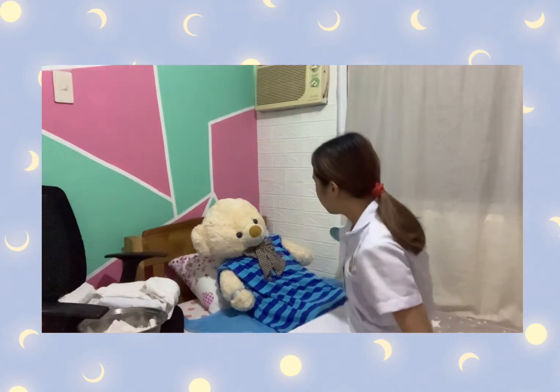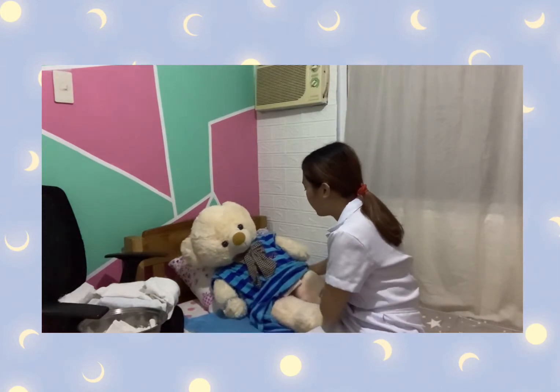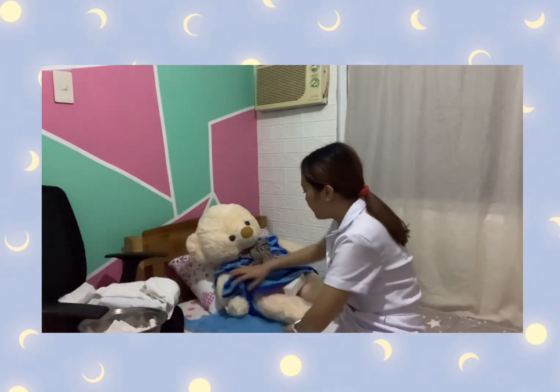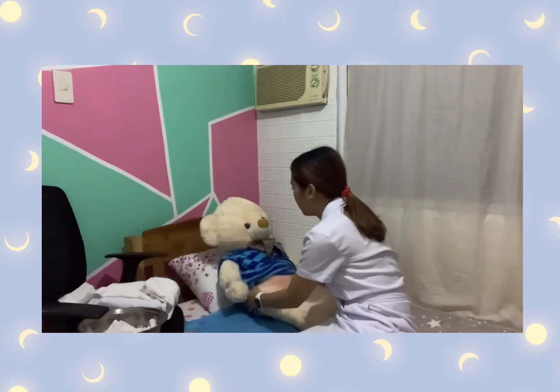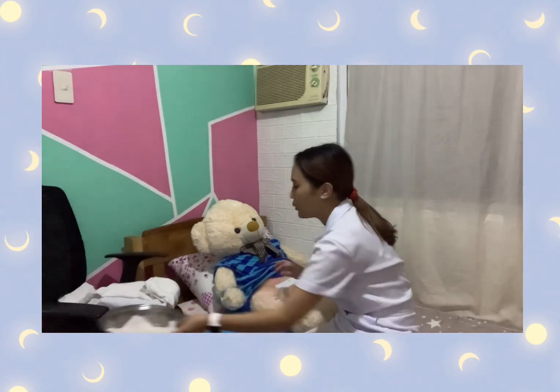And then, now is the time for us to prepare our patient. We will expose the genital area of the patient before we render perineal flushing. First, we will clean the perineum of our patient. So, ma'am, we will clean your perineum area na po. We will use a warm water with washcloth to clean the perineum area of the patient.